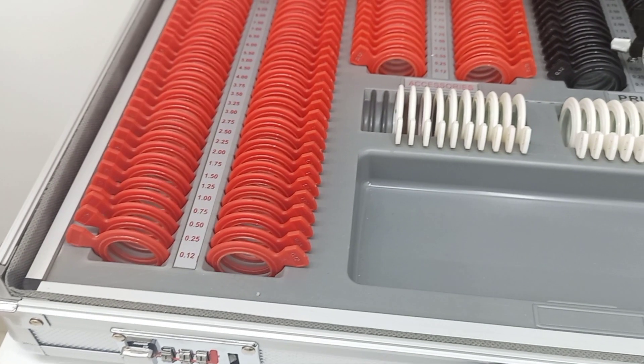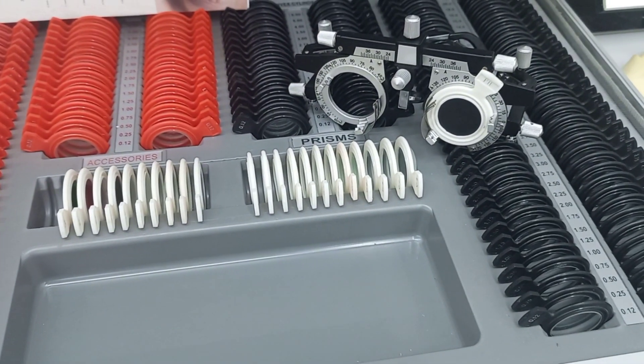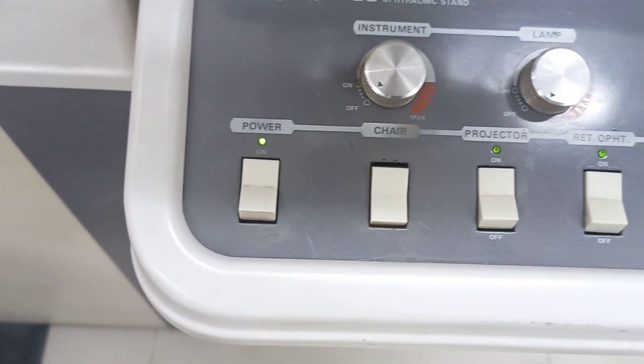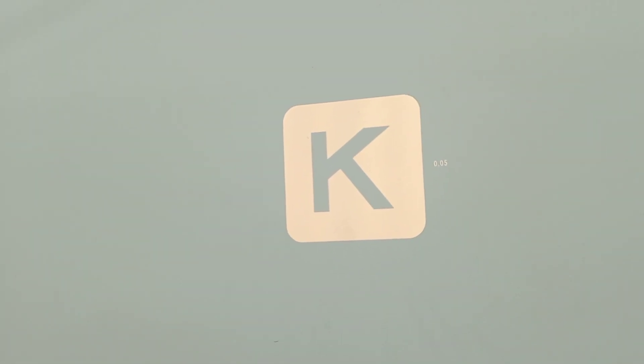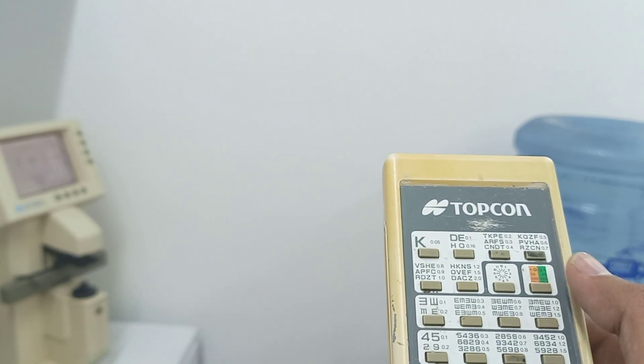The equipment required for this test includes a trial box, a universal trial frame, and a visual acuity Snellen chart. We also need to set up the Duochrome chart.